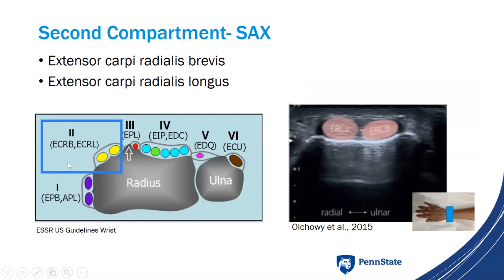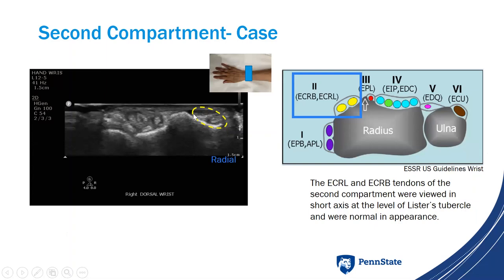Moving on to the second compartment — this is where we look at the extensor carpi radialis longus and extensor carpi radialis brevis. In short axis you'll see two tendons sitting over the radius, with Lister's tubercle just ulnar to them. For our patient, with Lister's tubercle identified and the second compartment visible, those two tendons were viewed in short axis at the level of Lister's tubercle and were normal in appearance.